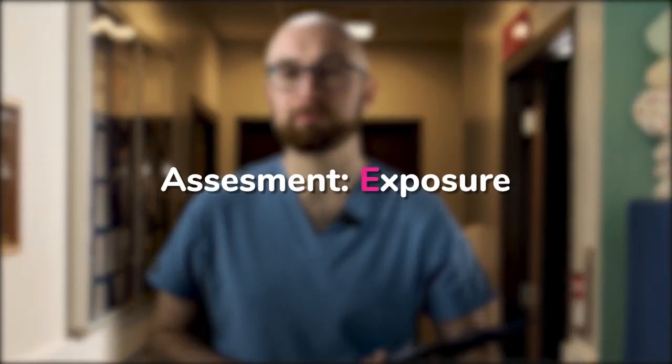Exposure assessment. In exposure, you need to assess the patient for skin rashes, wounds, pressure injury, signs of infection, bruises, and skin changes. It is very important to protect the patient's privacy, dignity, and temperature control throughout. The first step of assessing exposure is to take the patient's temperature.